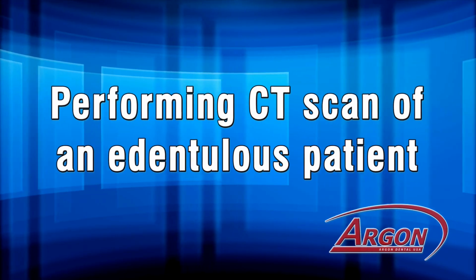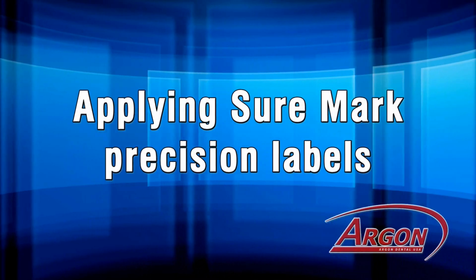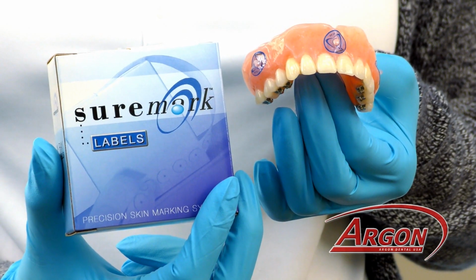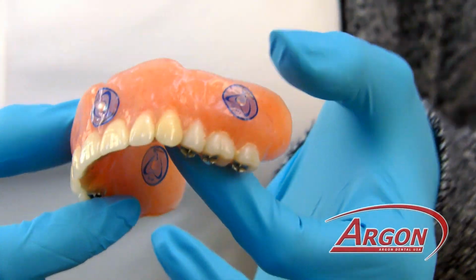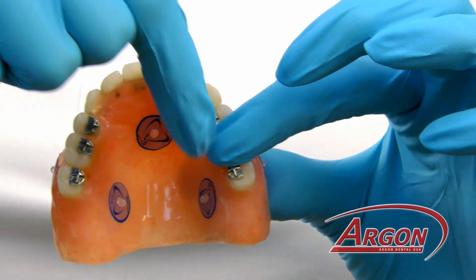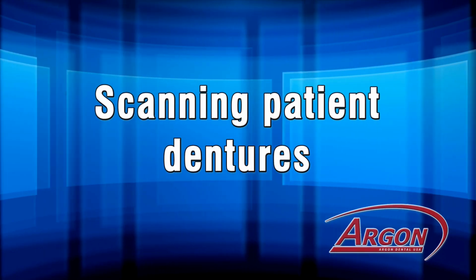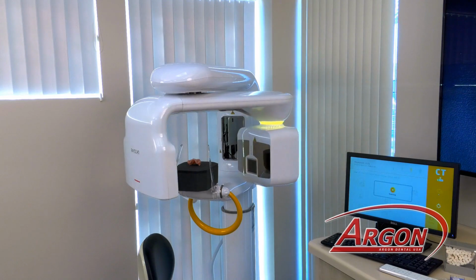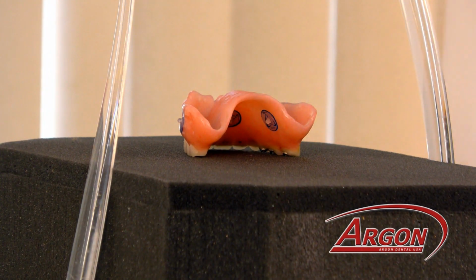Edentulous patients are handled a little bit differently. If you have an edentulous patient and you want to take a CT scan, we use SureMark markers. Take the denture out of the patient's mouth and apply 6 SureMark markers, 3 on the palatal side and 3 on the labial side. You would prop the patient's denture up using a foam or a box. Make sure that the denture is in the field of view of the CT scan and scan the denture separately.